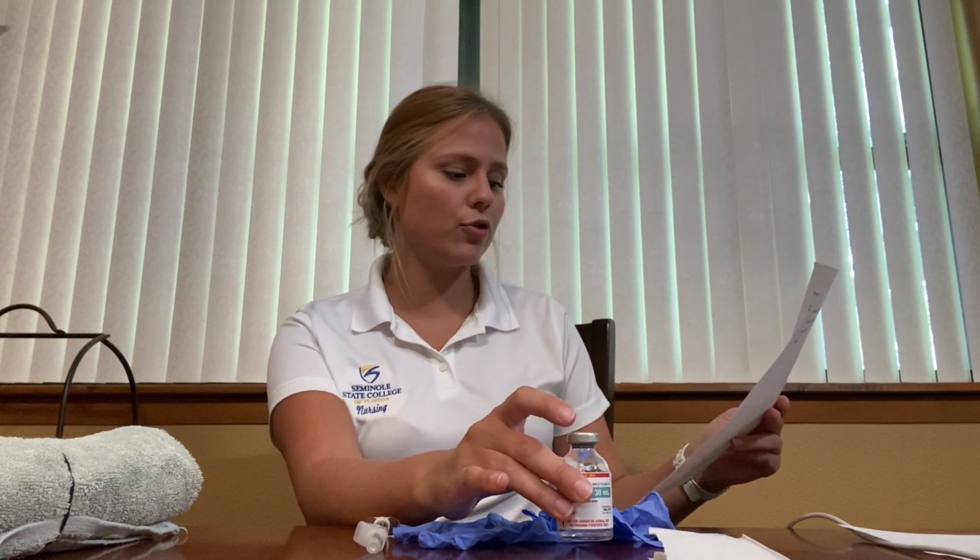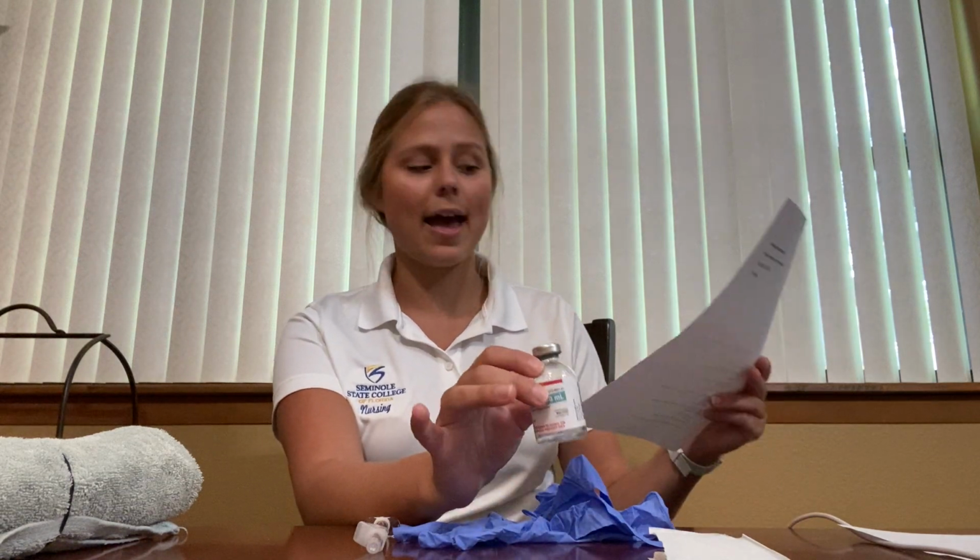And then this is where I'm going to be performing my second check. So again, locating the MAR, comparing to the drug. So we have Anna Pawlowski, right patient, right drug, B12, amount, 500 micrograms, 0.5 mLs, subcutaneously at 1500. Okay, and then I will get my vial.